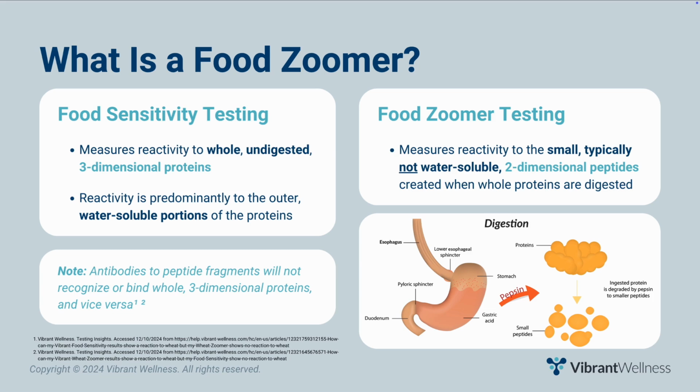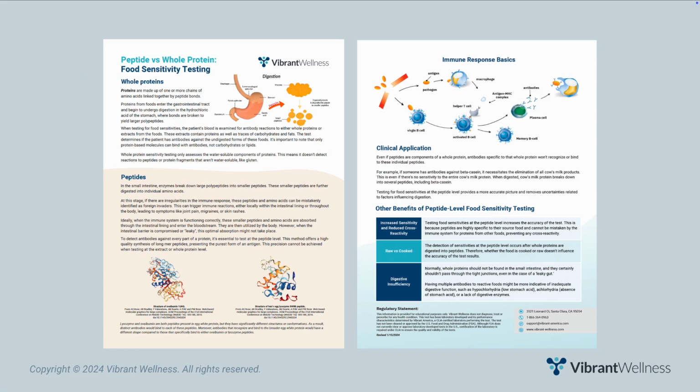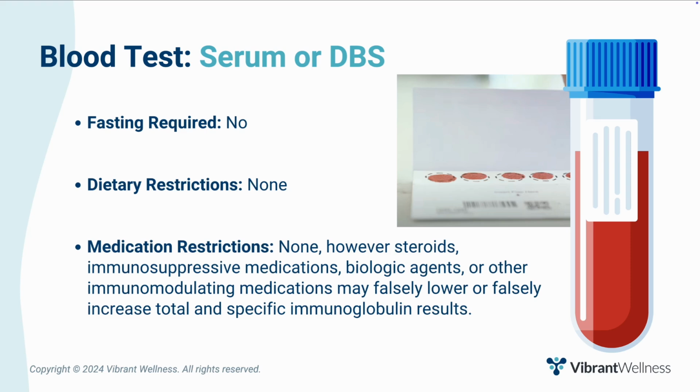Note, antibodies to peptide fragments will not recognize or bind whole, three-dimensional proteins and vice versa. To learn more, check out the peptide versus whole protein handout in your provider portal.